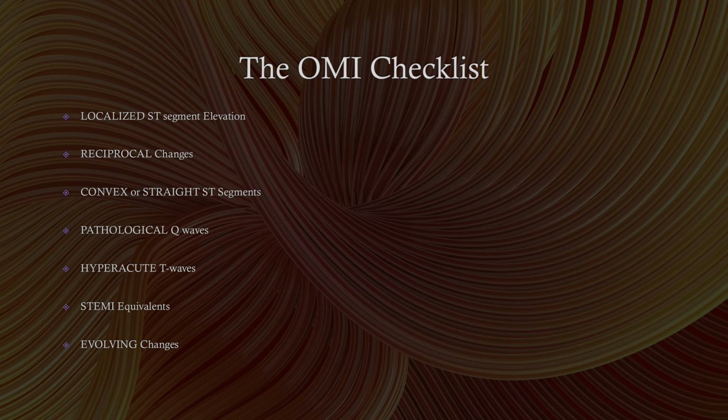So taking all those things in that list, the more of those boxes that are manifesting before your eyes, the more likely it is, right? Because the hallmark of the acute myocardial infarction is the acuity. It's the sudden onset. And so when you have maybe some questionable T waves and some interesting ST shapes, and you see more of this checklist manifesting in front of you, the more likely you're dealing with that transmural pattern, and the more likely we need to get that patient to definitive care.